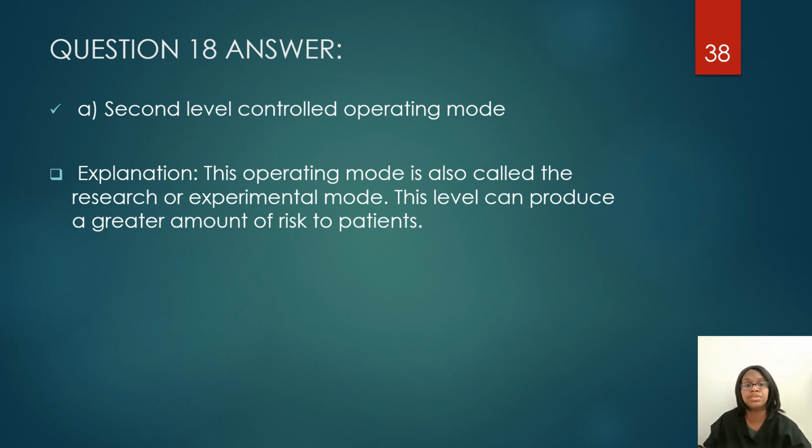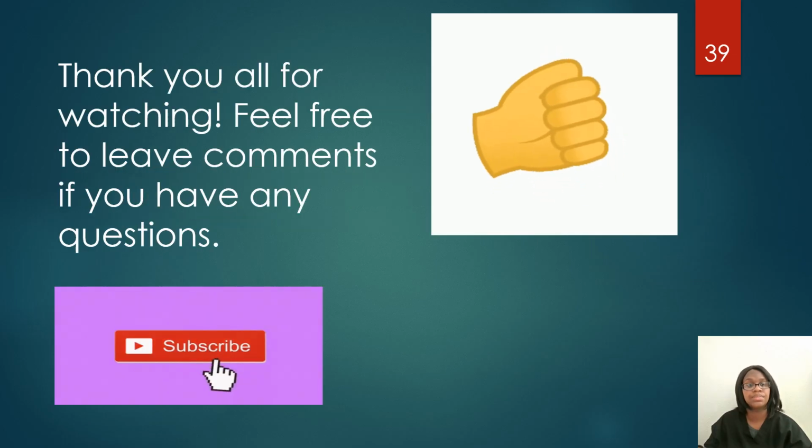This level can produce a greater amount of risk to patients, so do not use this mode on anyone. Like I was saying, this is pretty much for research or experimental. If you have a patient in the clinic or a patient in a hospital, they're walking and talking to you, they didn't tell you this is for research purposes, or you don't have an order from a doctor, you should always be scanning in normal mode.